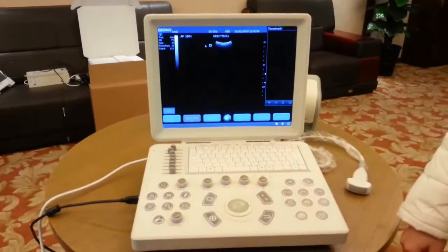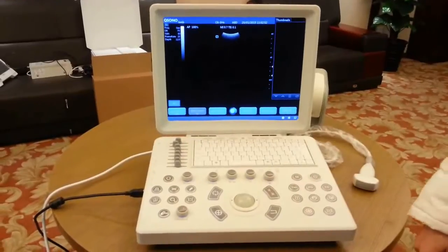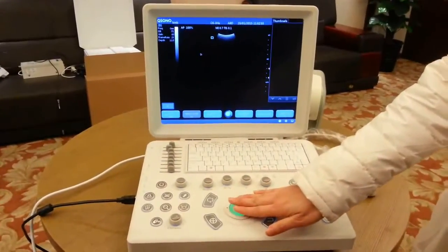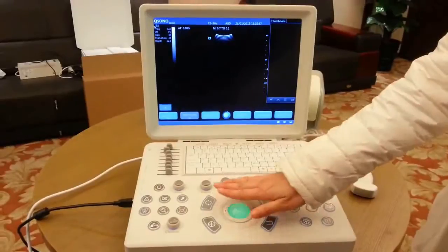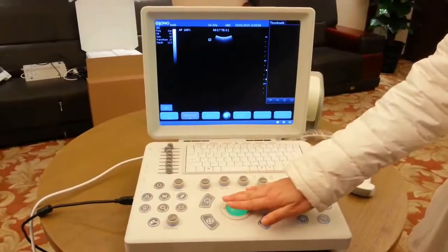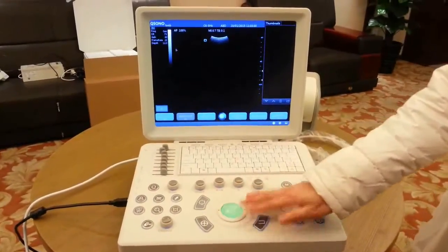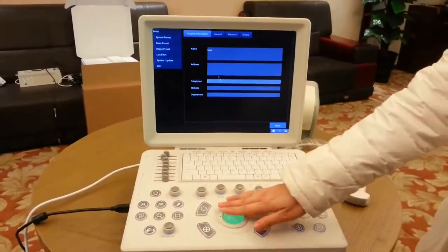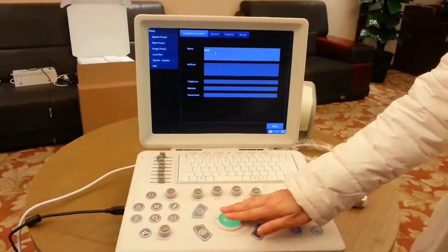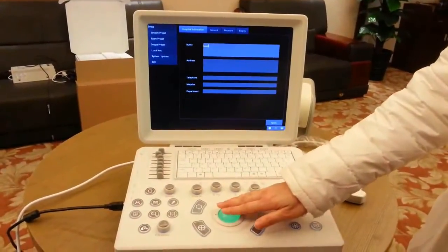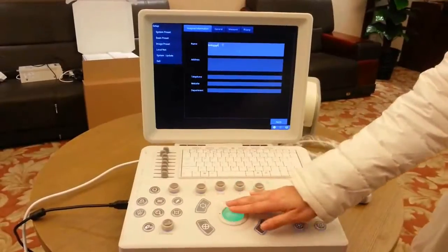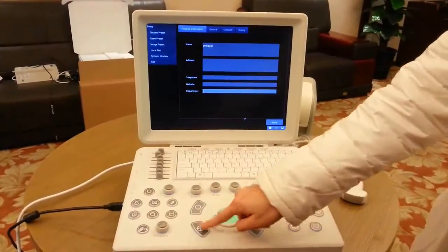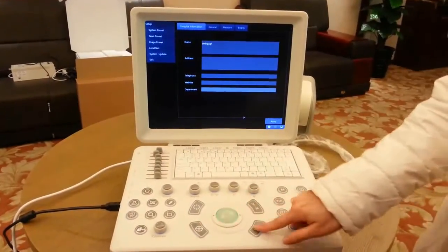If this is the first time you use the machine, you can do some settings for the system. Click the logo at the upper left corner on the screen, or press the preset key on the keyboard — it will enter the preset interface. You can fill in information, adjust time, and make other settings here. Press ESC to come back.